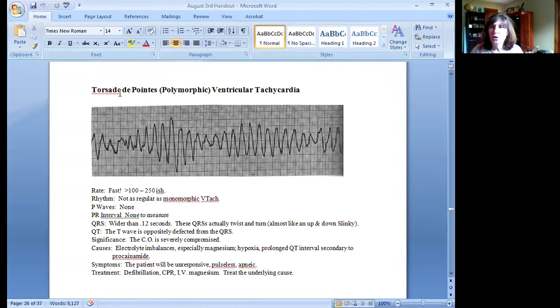That's why it is so imperative for us as nurses to check our EKG intervals at 8 a.m., noon, and 4. If my 8 a.m. strip showed me a QT interval of 0.46, and my noon QT was 0.50, and my 4 p.m. QT interval was 0.54, I'm picking up the phone. But only after going in to do an assessment and get a set of vitals and calling that doc armed and ready, looking at my MAR and looking at my labs.